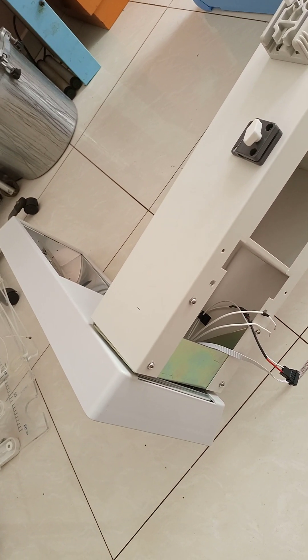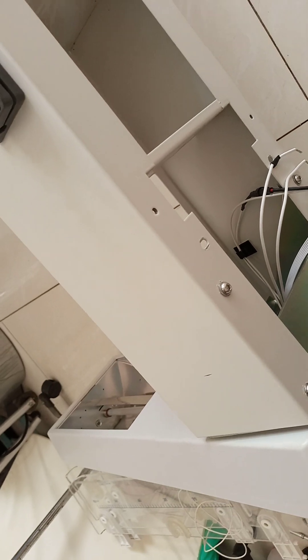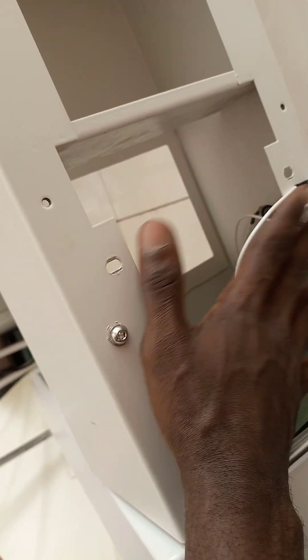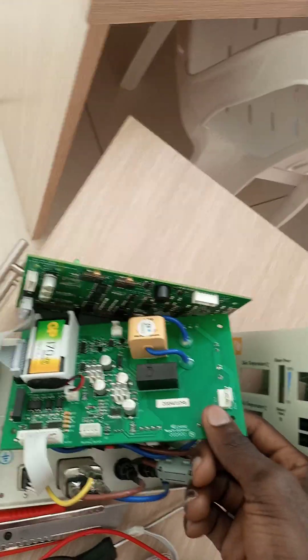I powered the machine and measured the voltage at the terminals of the heater. It turned out there was no voltage, which means the cables were not bringing power to the heaters — that's why it was not heating up. The control board is supposed to be located here.